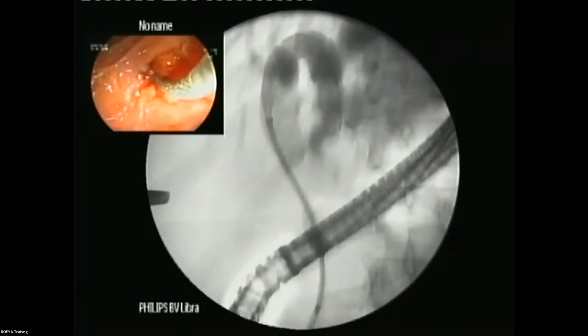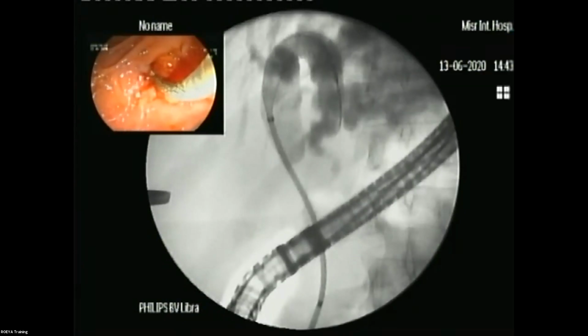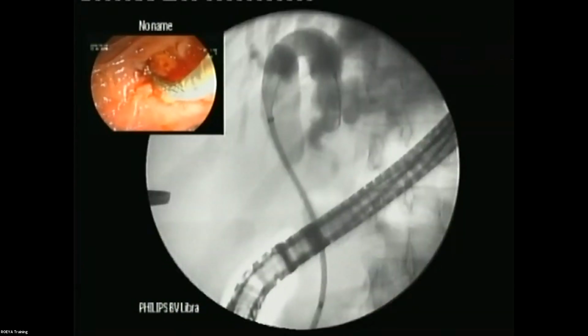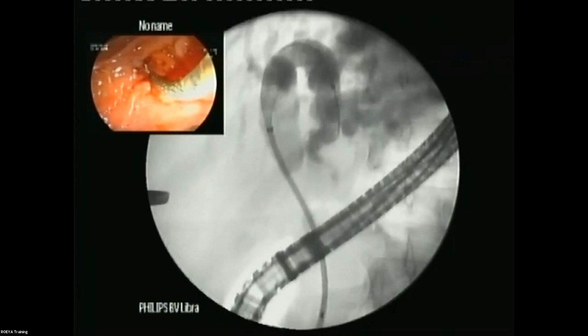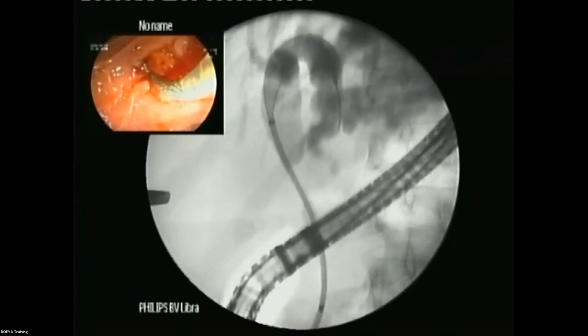Ibrahim, you need to look down, Hani, and you are looking up. So you answer. I cannot answer. No pressure at all. But look down, because on the fluoroscopy, for me, it's not important at all. What's important is the endoscopic view.